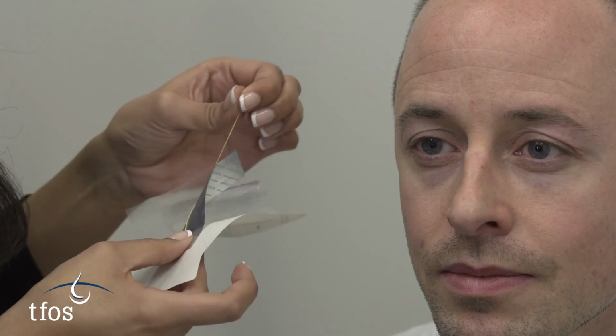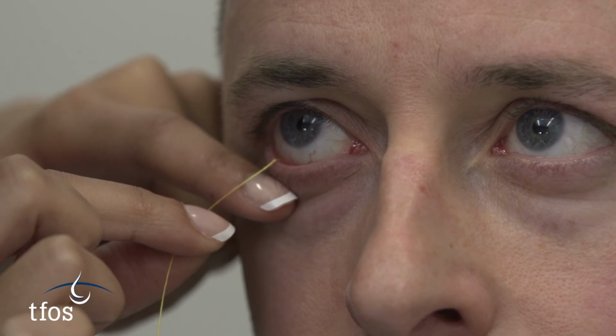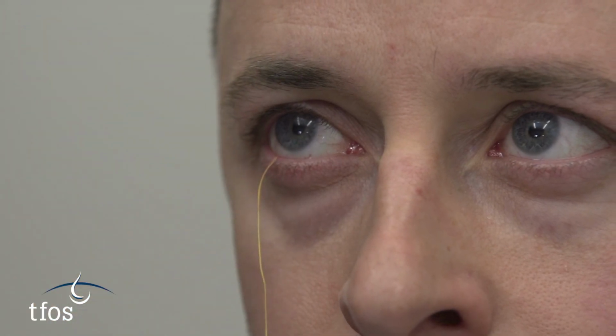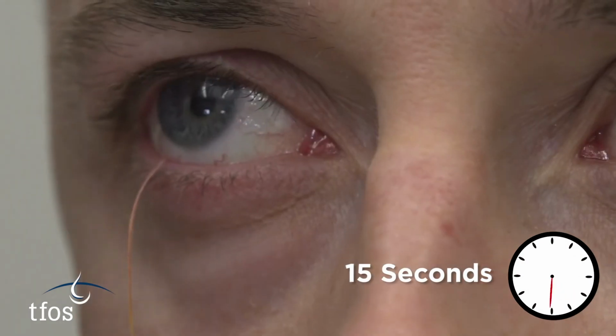The phenol red test is a less invasive alternative to the Schirmer test, using pH-sensitive cotton thread rather than filter paper. The hooked end of the thread is placed over the lower lid margin, again in the lateral third, and is left in place for only 15 seconds before measurement.